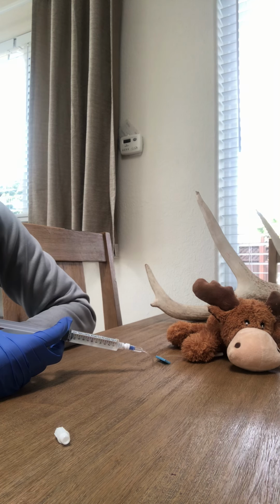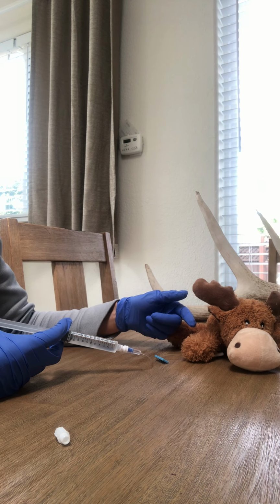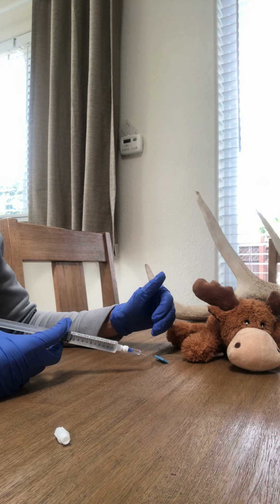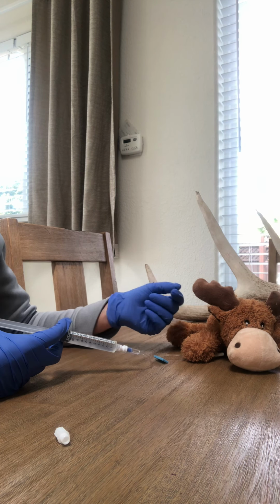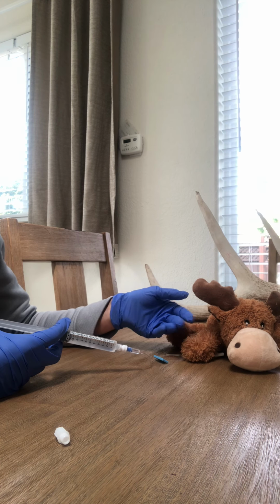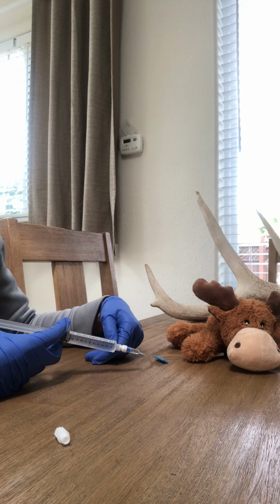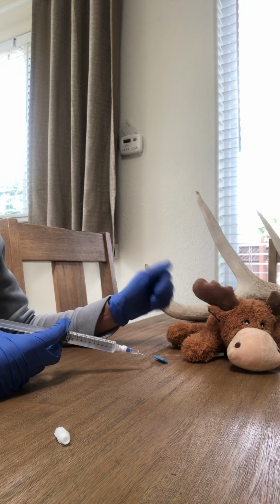While I'm pushing the saline, I'm just looking for any infiltration at the IV site, and I'm also assessing for resistance. If resistance is met, I would remove the saline and assess why there might be resistance, and I'm also going to be looking to see if the patient is having any pain while I'm pushing the medication.